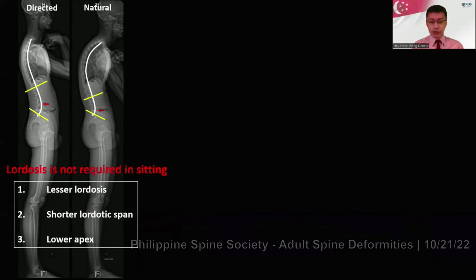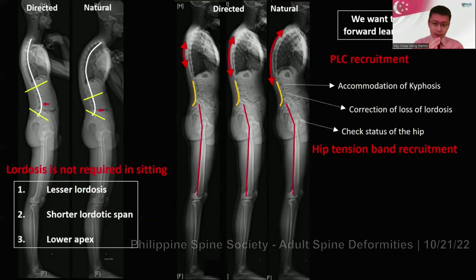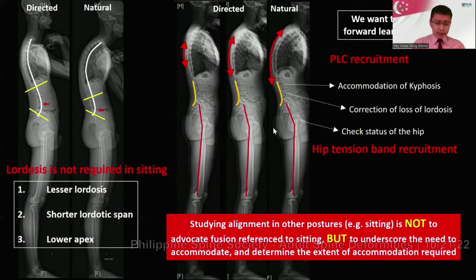So you want to go for less lordosis, a shorter lordotic span, as well as a lower lumbar apex to allow accommodating segments higher up, because you know that you're going to fight a battle in the cranial portion at the junction. So remember the T10 angle we're talking about and the T8 to T12 angle, the COP angle, to dial in as you try to accommodate the junction to the natural spine. So to have a correcting segment in the lower lumbar spine, as well as the kyphotic segment, based on the angles mentioned earlier, to tackle the junctional force from above.